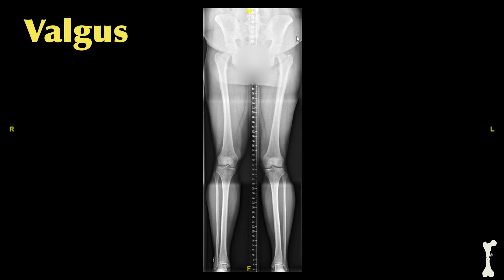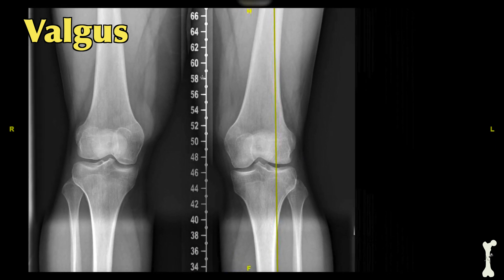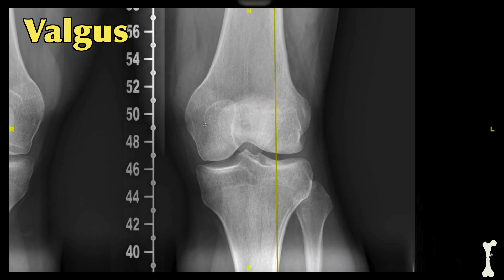On this x-ray we're going to demonstrate valgus alignment, also known as knock-kneed alignment. We'll start again at the center of the hip joint, or the center of the femoral head, and draw the mechanical axis of the entire extremity down past the knee joint to the center of the ankle joint. This line represents where the majority of the patient's mechanical loading passes through the extremity. Zooming in on the knee joint, we can see that this patient's mechanical axis passes through the outer side of the knee joint, which we call the lateral side or the lateral compartment.